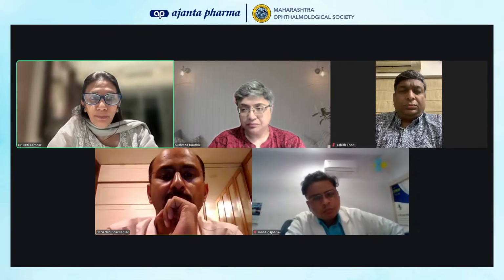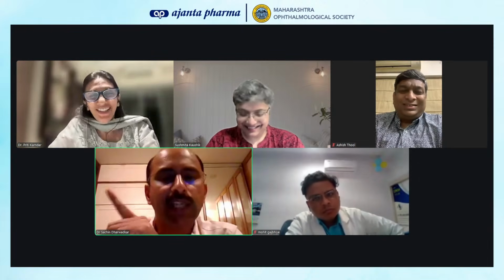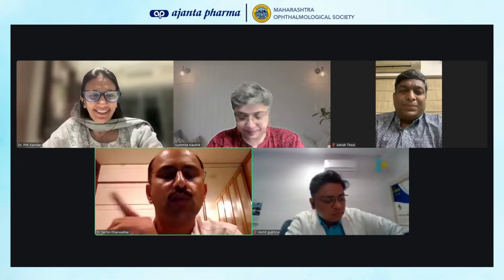Because if everybody starts using this, 5 microns change as progression, most of them will start operating on patients. So we don't want that. So that's what I'm saying. You can use it provided you're responsible enough in using the machines and you know what you're doing.